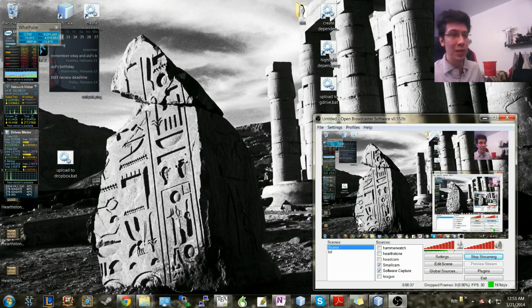We have alternative mouse technologies like mice that you can use with your feet, and mice that consist of a webcam placed on your monitor that looks at you and, for instance, analyzes your facial features to determine which way your face is looking, using that to position your cursor in an absolute sense on the screen. So if you're looking to the left, the cursor is positioned on the left of the screen. And there are also some that use infrared lights to shine. You stick a reflective dot on your forehead and it tracks the reflective dot. Some of them track gaze. All of these techniques have downsides, some of them quite major.